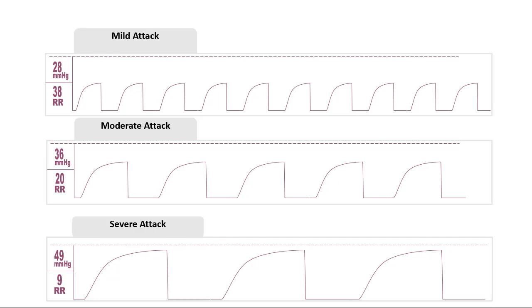Notice the respiratory rate's at 38. They're breathing really fast. Because they're breathing off to compensate, their end-tidal CO2 is lower than normal. Now they're tiring out. They're starting to slow. Their end-tidal CO2 is rising. And now they're really tired. End-tidal CO2 is pretty high.